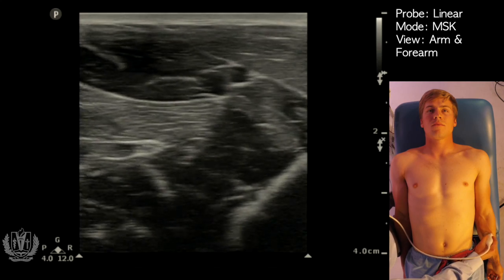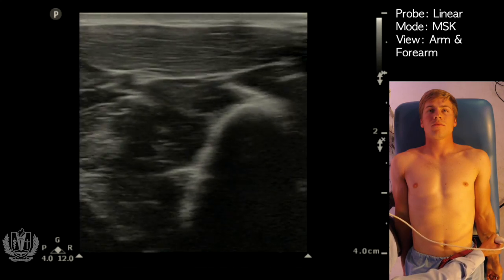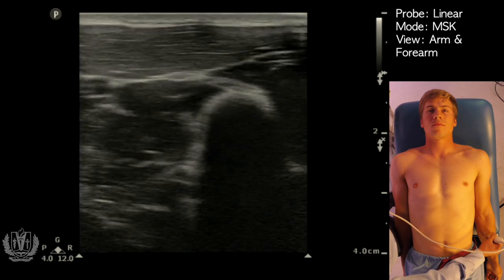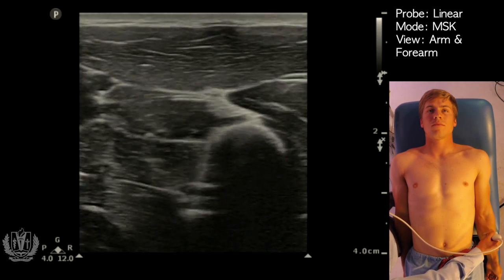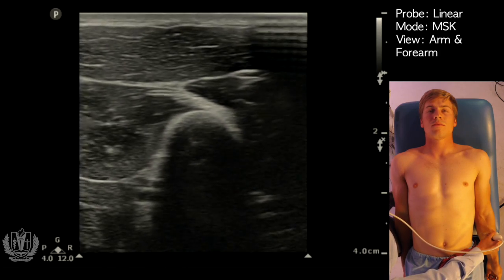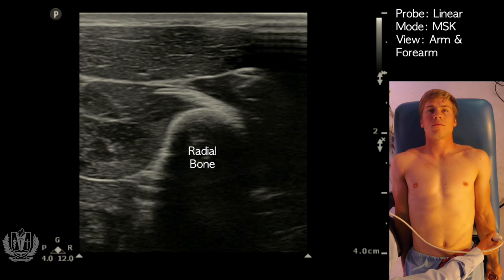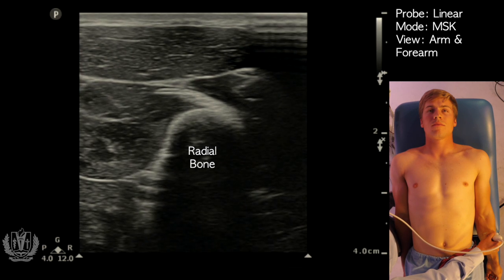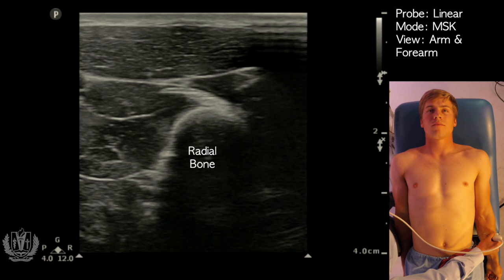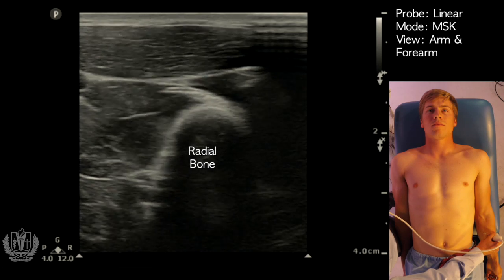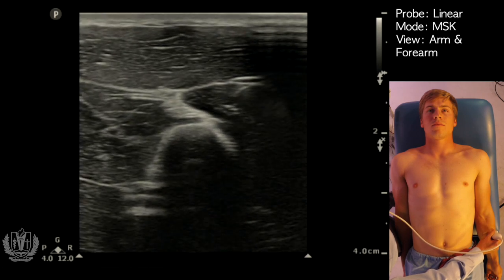Another thing you can see with musculoskeletal ultrasound is bones. Here I'm going towards his radius, and that's his radial bone right in the middle of the screen. You can see it has a very hyperechoic cortex, and it shadows because it's so dense that ultrasound waves cannot pass through. That's what the appearance of bone looks like.